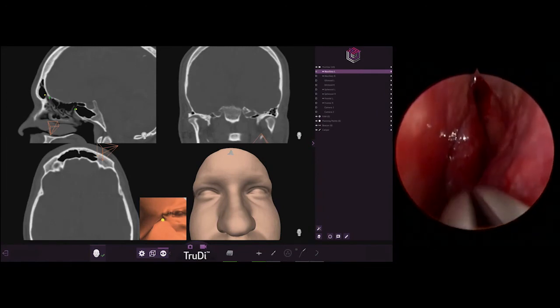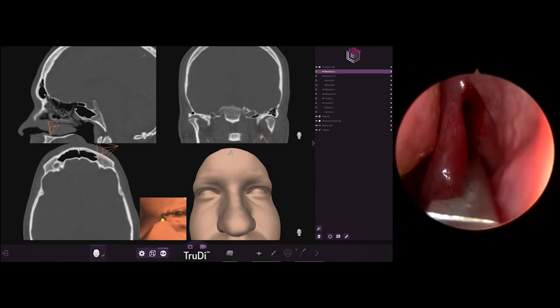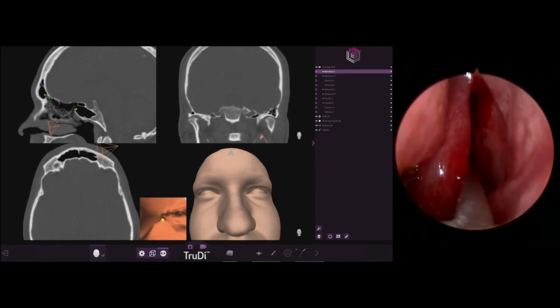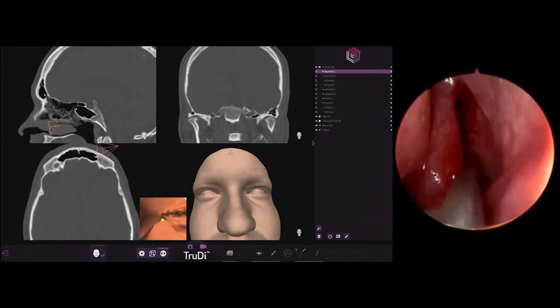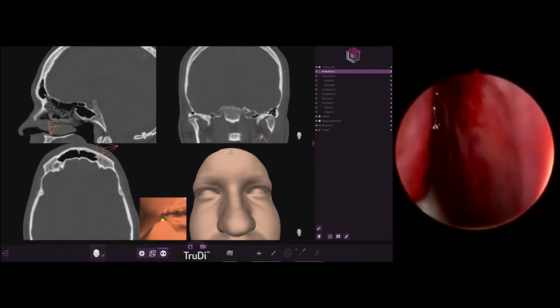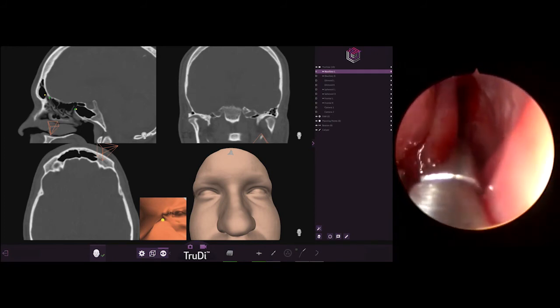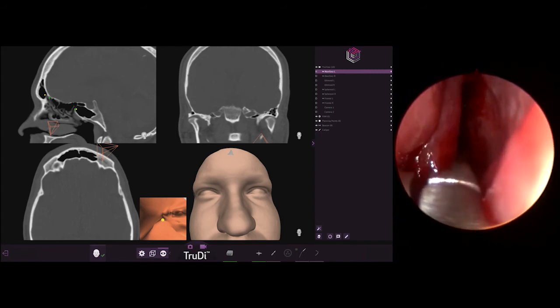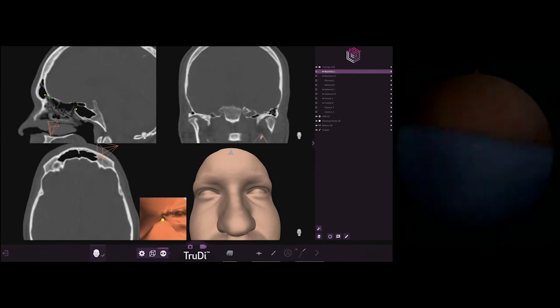Treating a concha bullosa, I think, is always important. And while typically in the operating room I might resect the lateral lamella, in the office we'll take a less aggressive approach and we'll simply use a duckbill type of instrument to help treat that, which not only eliminates some of the obstruction, but of course makes accessing the maxillary sinus a bit easier. Suction.